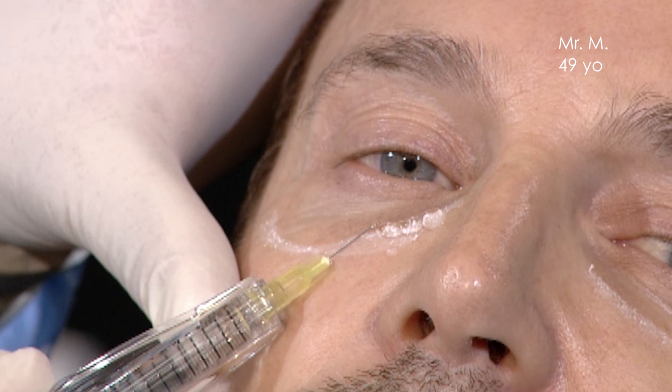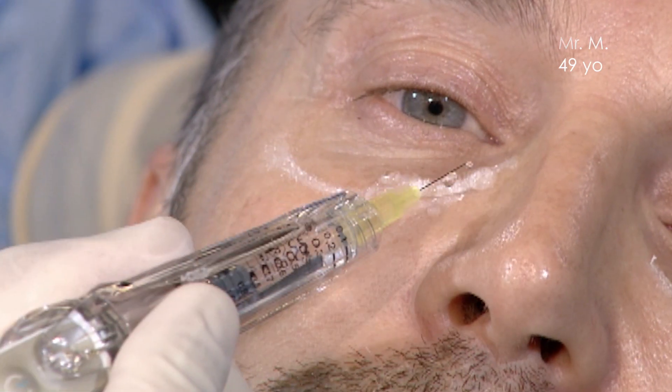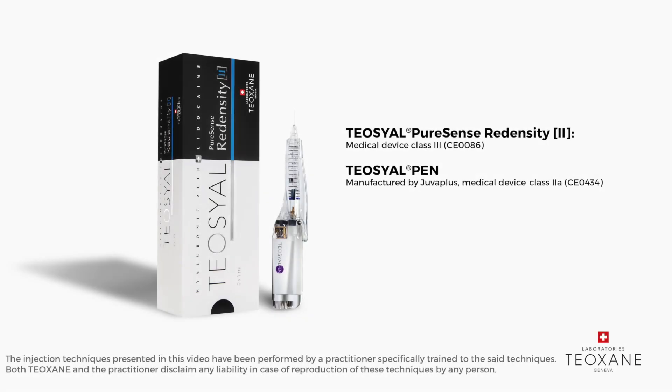I want to show you, when you inject on the skin, what is the real volume that you will inject. You can see the product here, and you see the real quantity you have to inject. And it was only 0.1, and then I will inject near the bone.